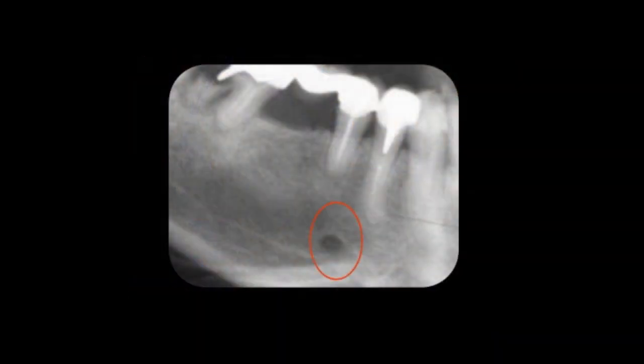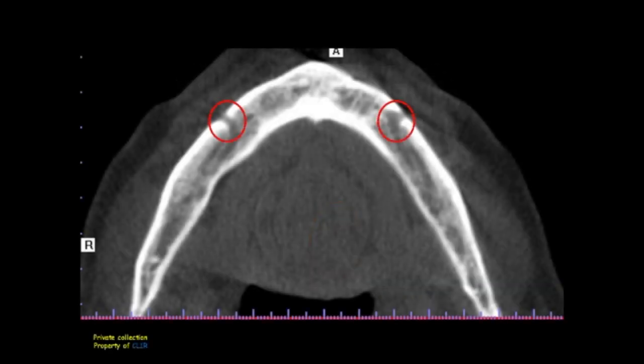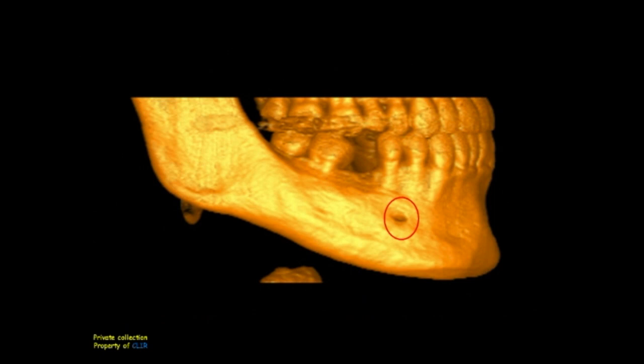On a 2D periapical radiograph, the mental foramen appears as a radiolucent area between the premolar apices. On an axial 3D cut, and according to its morphology, the exiting mental canal is seen as a radiolucent canal in the continuity of the inferior alveolar canal. As for its position, usually the canal is between the two premolars, or in close relation to the apex of the second premolar.